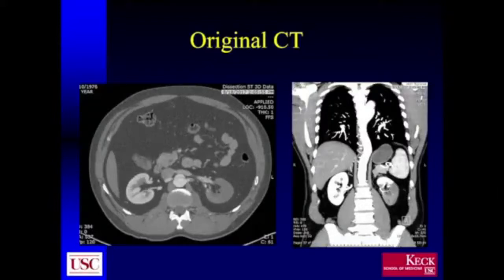In this particular case, the clinicians wanted to know what to do with him since it was now 48 hours after the initial CT, and you can see that the contrast ultrasound confirmed that the findings that were seen on the original CT remain, and that basically the kidney was non-viable after 48 hours.